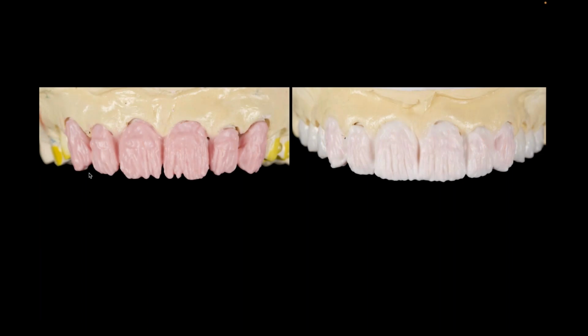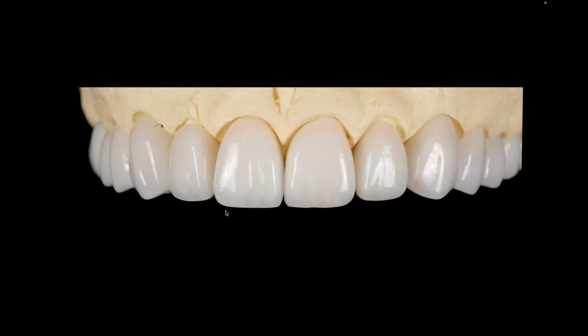So again, micro layering, I build up my opacious dentin, my dentin materials, and I start to shape that dentin canvas. And then I'll go right to my mamelon materials with a little bit of a blue translucent, a mamelon 1 or a mamelon 2. Maybe I use an effect chroma sometimes, depending on what I'm looking to create in my mamelon structure. Again, she didn't want a lot of translucency.